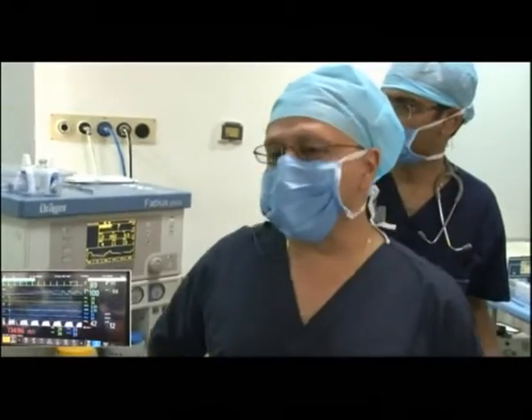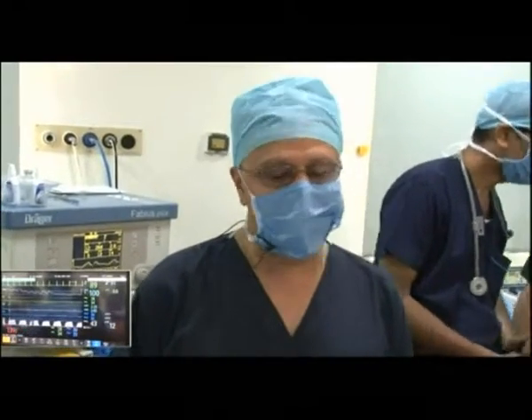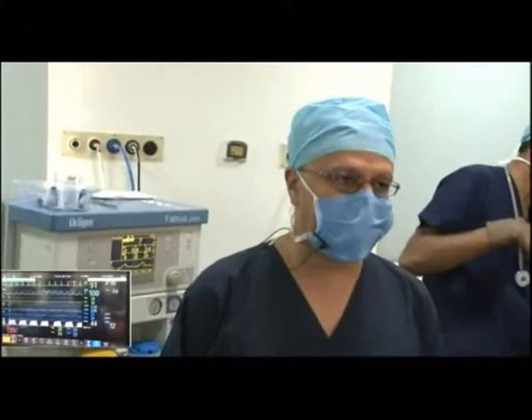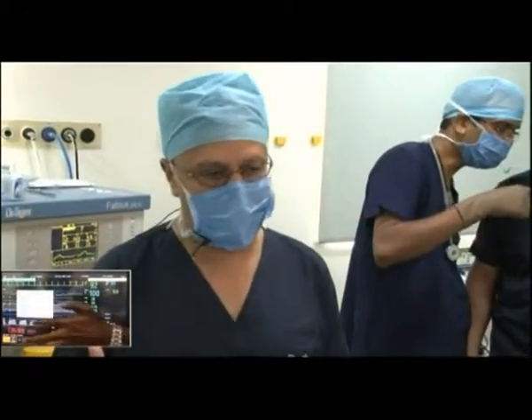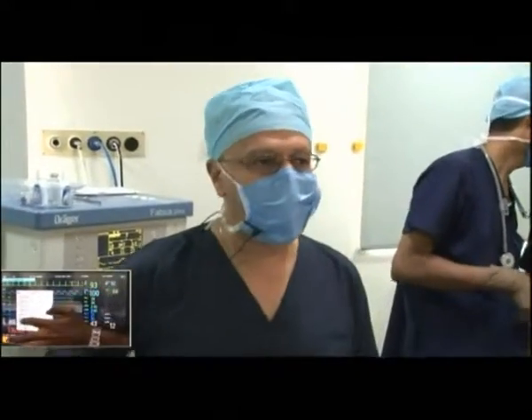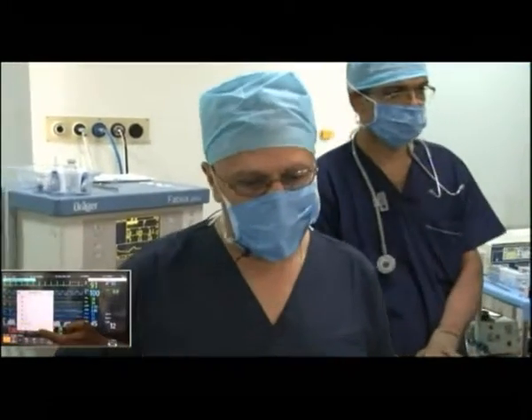Let's say because of abdominal insufflation, the intrathoracic peak pressures are going up, then you may contemplate using pressure control ventilation. That allows you to give the same tidal volume but at a lower peak pressure. So that's another option you could have. If you do that, just keep in mind as the patient's muscle relaxation wears off, the intercostal muscles will contract, and so you would get less tidal volume for the same peak pressure. So you've got to be a little bit more vigilant.